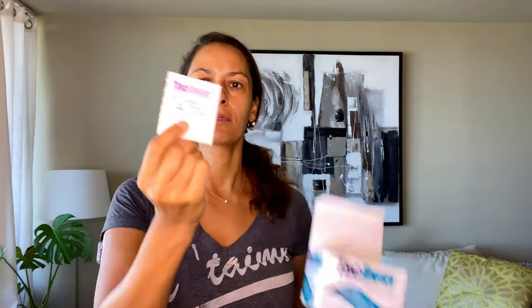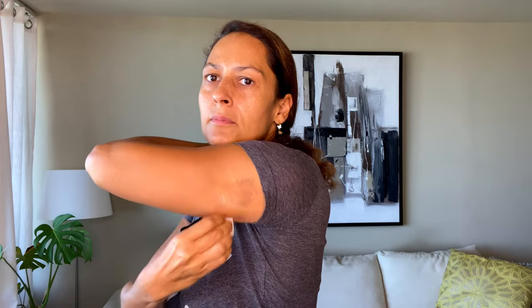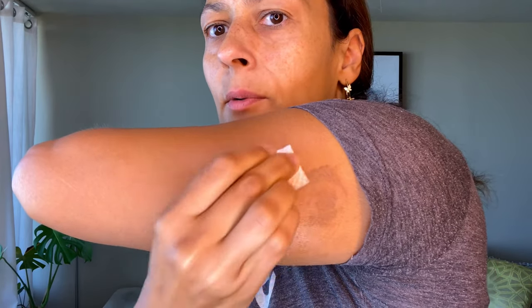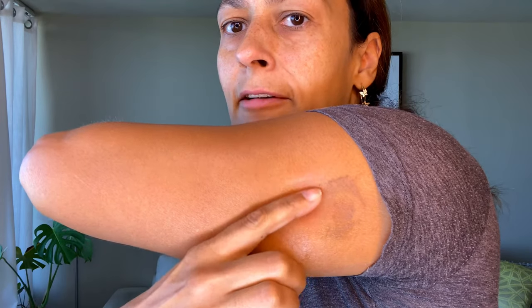Let me show you how both work, starting with the Takaway wipe. I only have one left in this box — you can see it's a fairly small wipe, so I'll do about half the residue with this one. You just wipe it down and you can see it's slowly working. You do have to work a little bit, but you can really see it coming off. It requires a little bit of work, but it took off about half the residue.